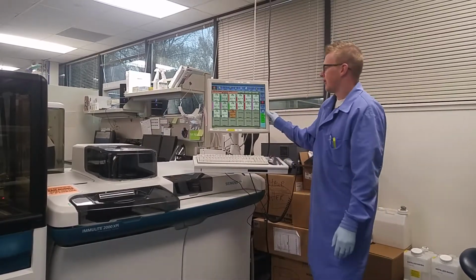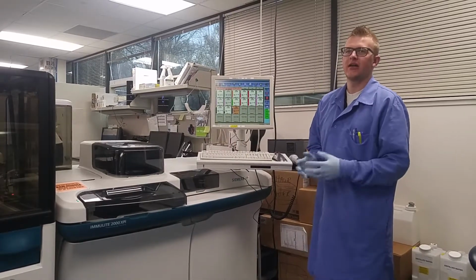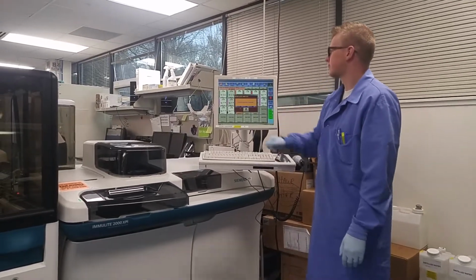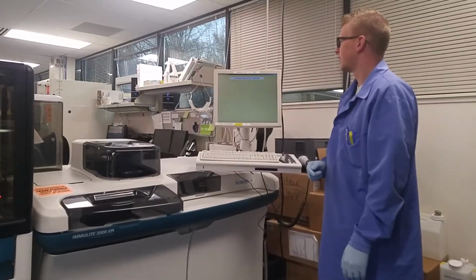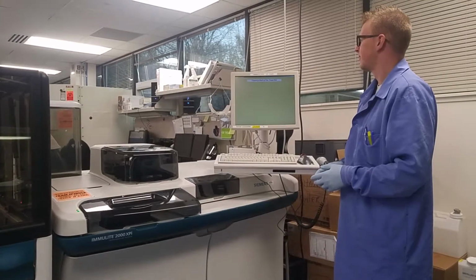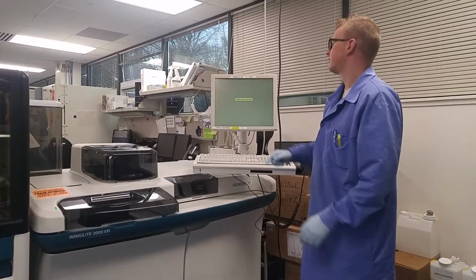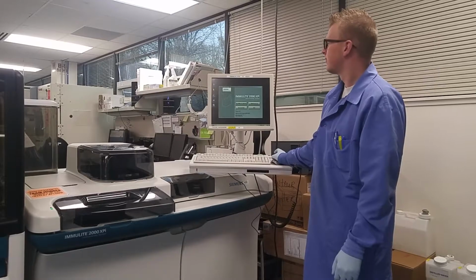At this point, we're going to imagine that you have a flag here that says a Clot error has been detected. First thing you'll do is abort all testing. You're going to log off the system. The analyzer will then back up any unsaved files. With this message, you just hit continue. And then we're going to go in and hit diagnostics.